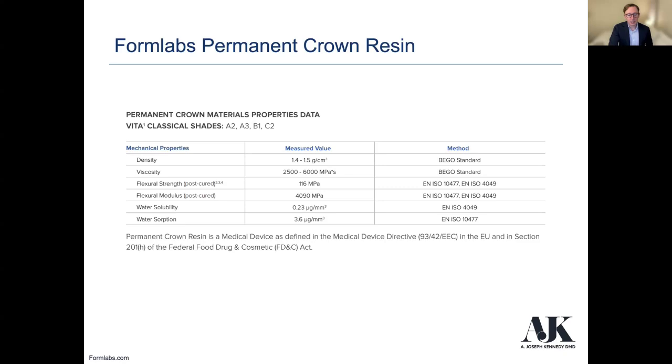Not as strong as an Emax or zirconia, where the flexural strength of an Emax, as an example, is anywhere between 350 to 500. Zirconia is stronger at about 600 to 1200.